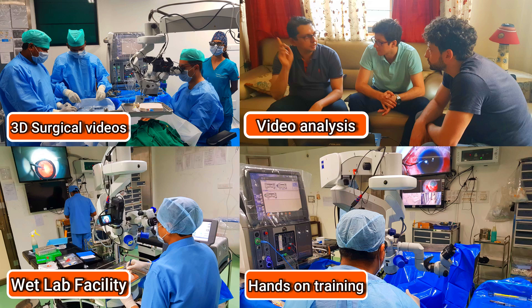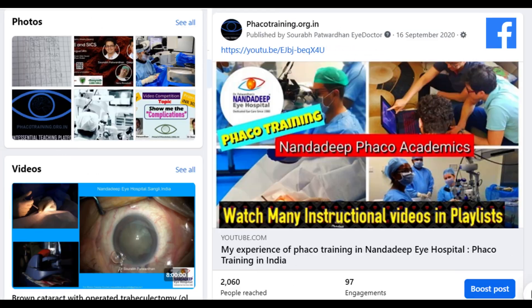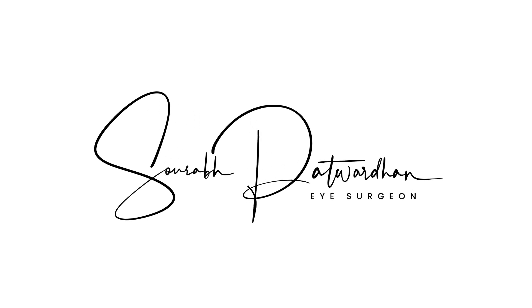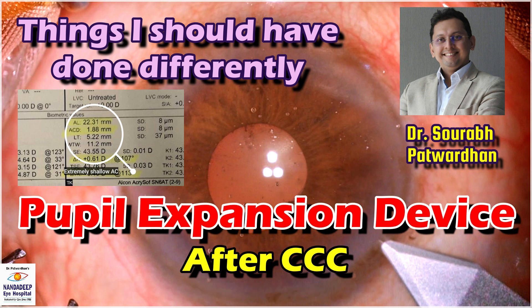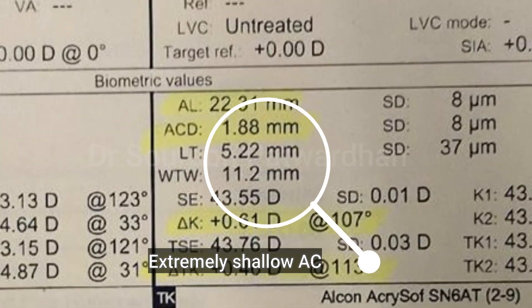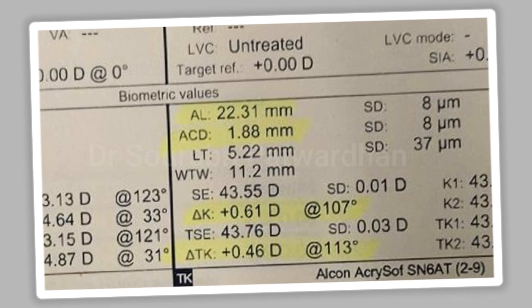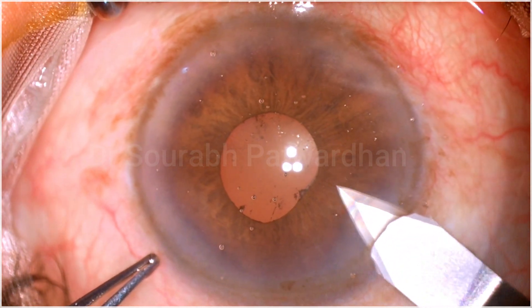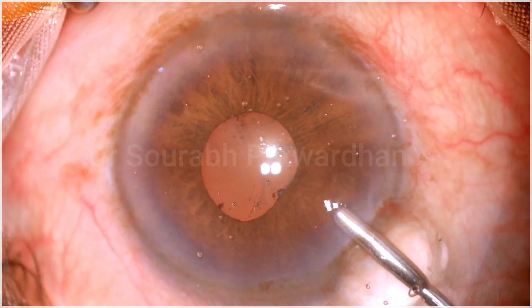In our center, we have a lot of teaching activities which includes hands-on training as well. In this video, I will be speaking about a case where there is extremely shallow anterior chamber and small pupil. This is the biometry — you can see the anterior chamber depth is just 1.88 mm. The patient had some episodes of angle closure previously and YAG peripheral iridectomy has been already done. You can see some synechiae as well, indicating that there has been some inflammation before.